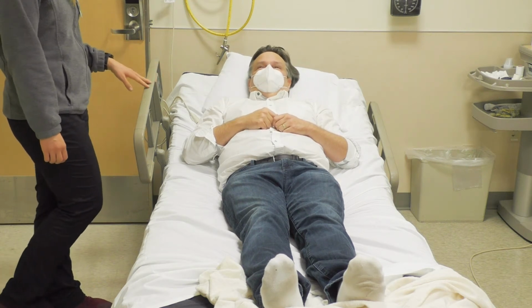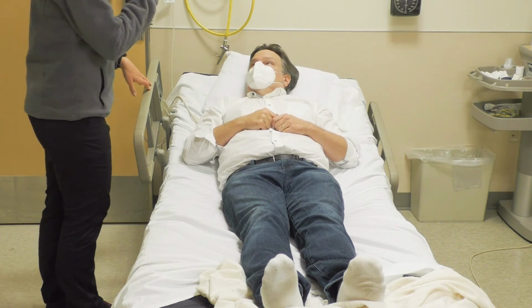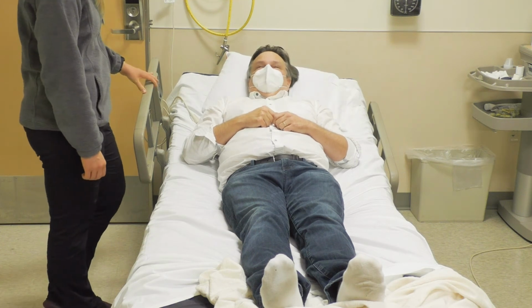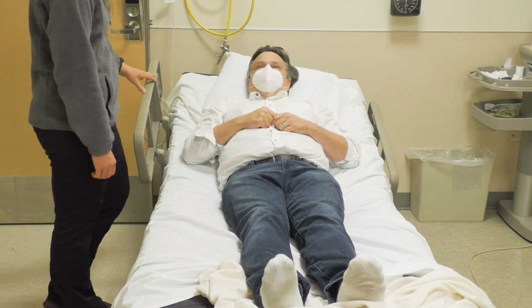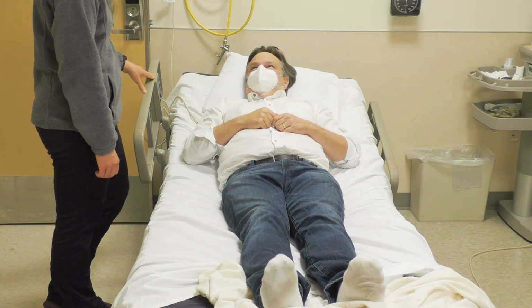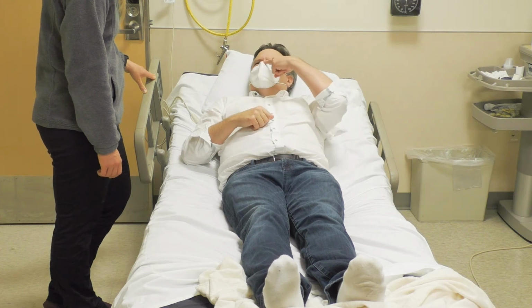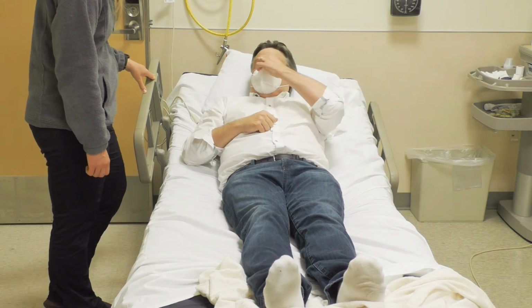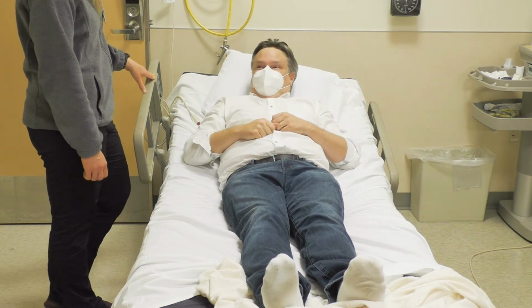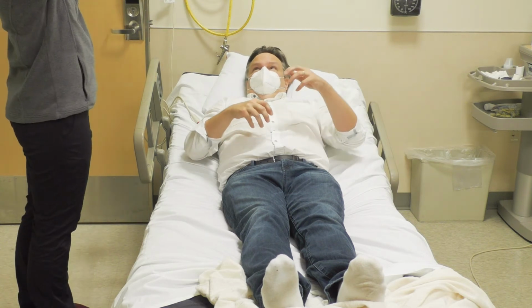Ask them to name something, a pen or a clock. Can you tell me what this is? That's your badge. Perfect. Have them touch their nose with right or left hand or point to the ceiling. Can you touch your nose with your left hand? Perfect. Can you point to the ceiling with your right hand? Have them raise their arms. Can you raise both arms up for me?